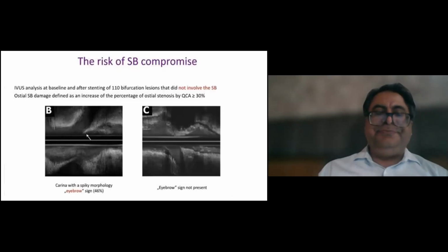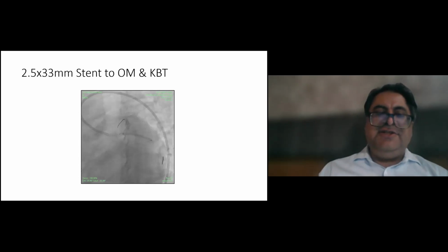And do the POT. Also with IVUS, we saw there was an eyebrow sign which showed us that if we go from left main to LAD, there might be a pinching of the LCX, and the LCX is diseased.